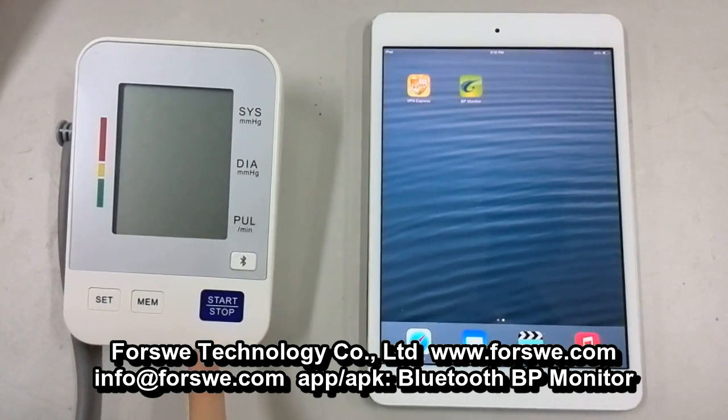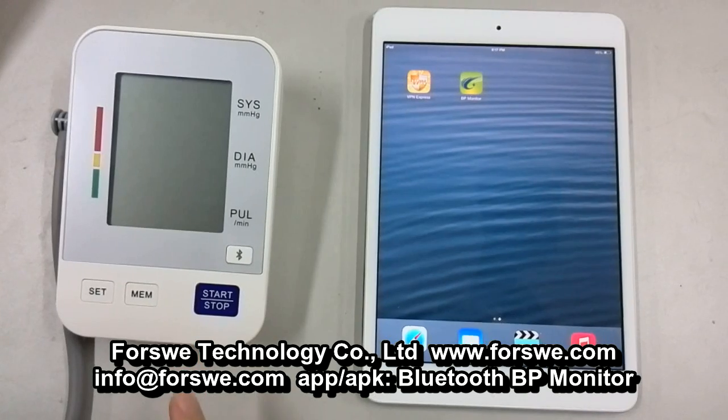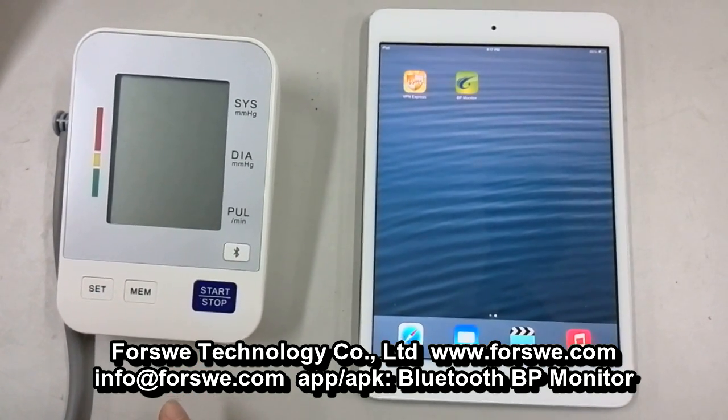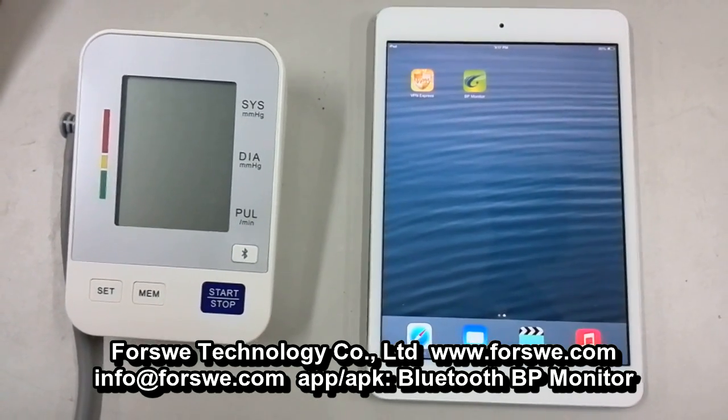This is our newly designed Bluetooth blood pressure monitor. It can be used with iOS and Android systems. Now let me show you how to operate on the iOS system.